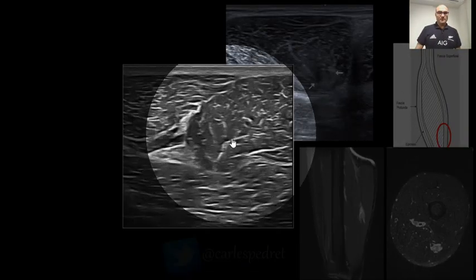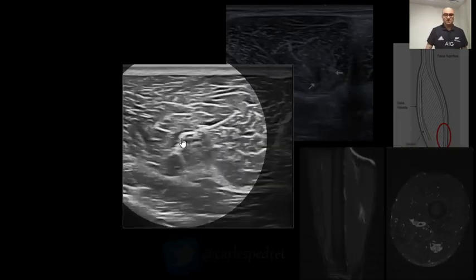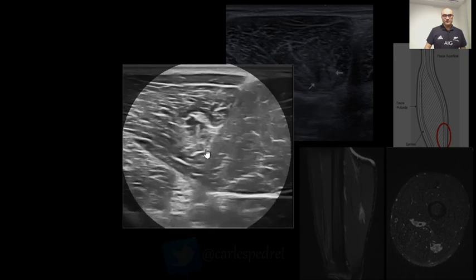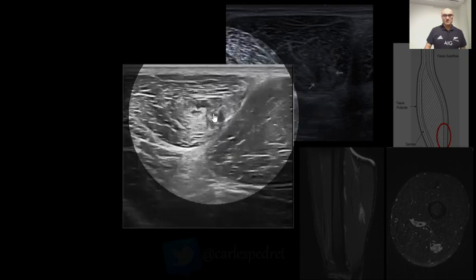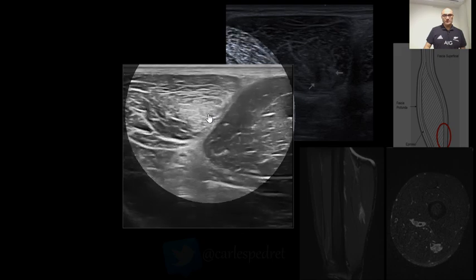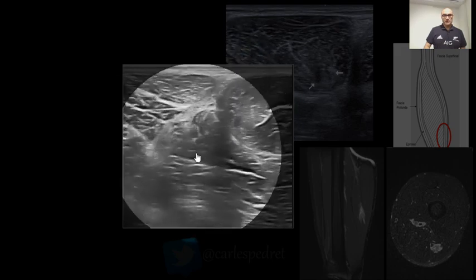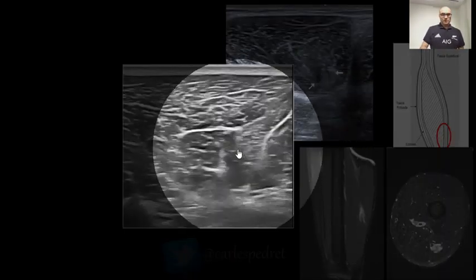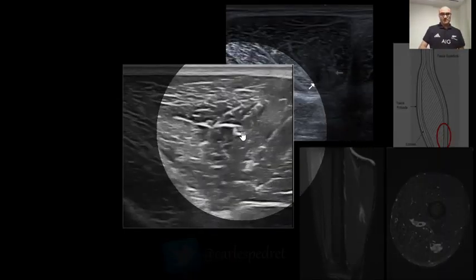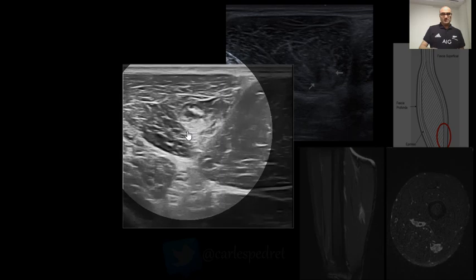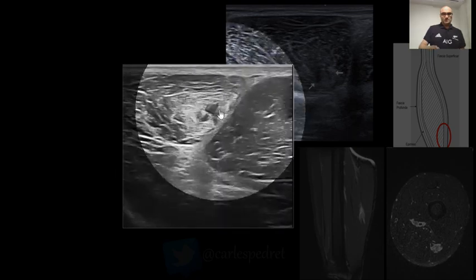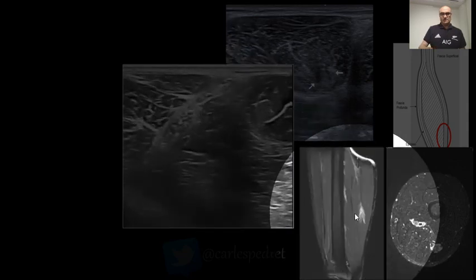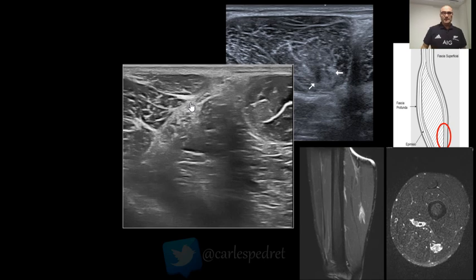We can see here another, maybe bigger case. You can see here the aponeurosis, and here you can see this injury much better. Let's put the video again — you can see here the aponeurosis rotating there. Here is the aponeurosis at the end, intramuscular. And here you can see the image of the distal part of the tendon, as you can see much better in the MRI.